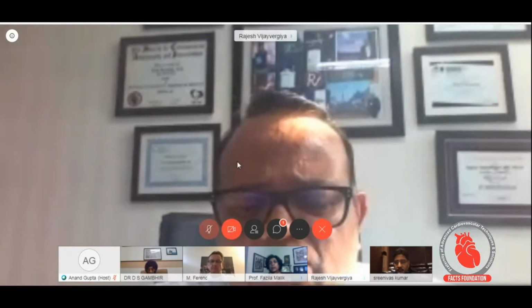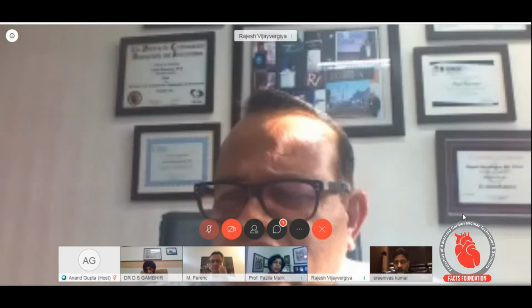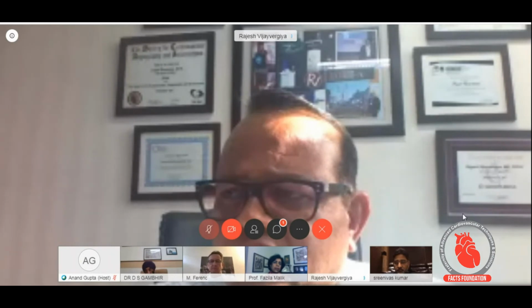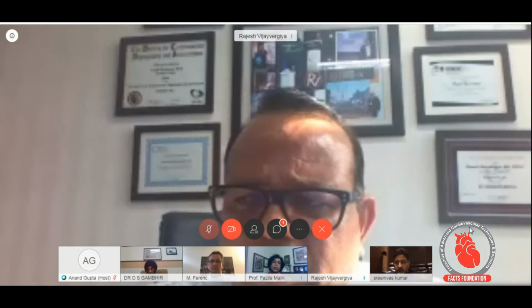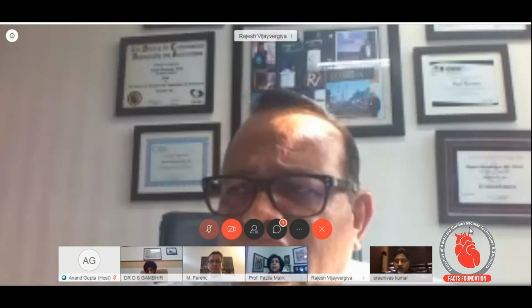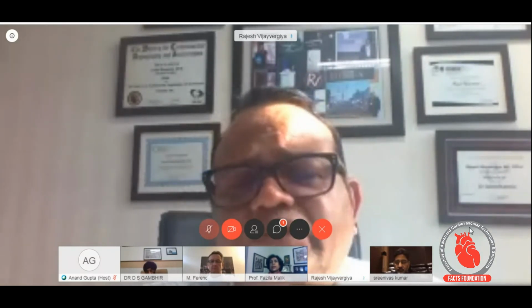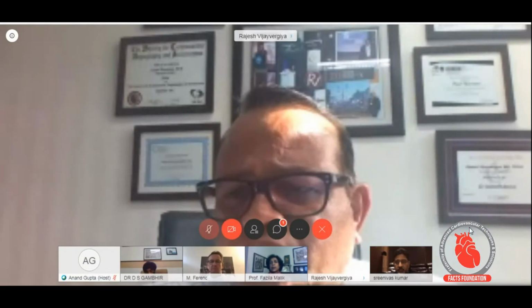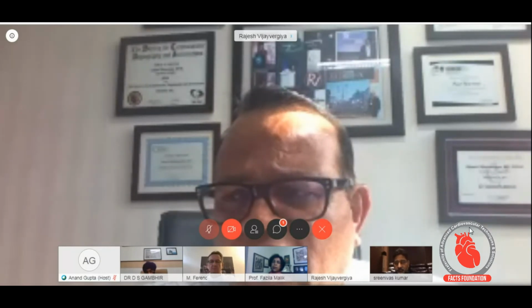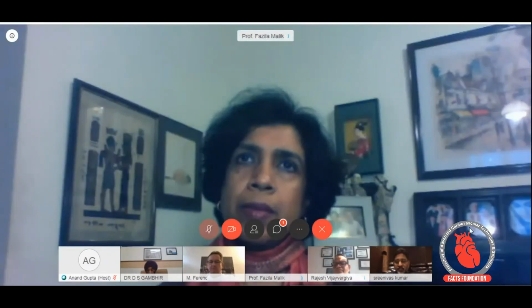Regarding the no flow or slow flow, people do use nitroglycerin, nitroprusside, but I have seen in such situations, when there is rapid deterioration of the patient, it's better to give intracoronary adrenaline. I have seen a great response in my patients, and it does help in rescuing the patient. So that is an alternative not routinely used for slow flow or no flow phenomena, but it has a very impressive result. So Professor Ferenc, what is your drug of choice if you get slow flow, no flow?